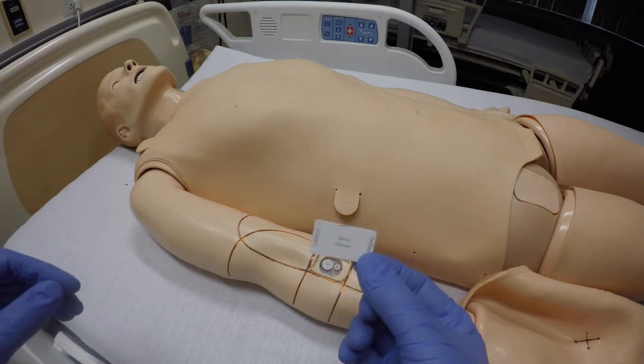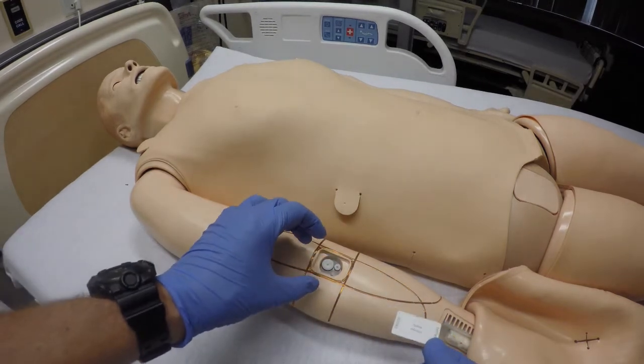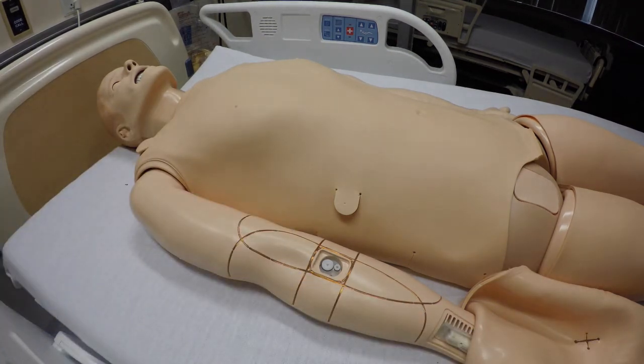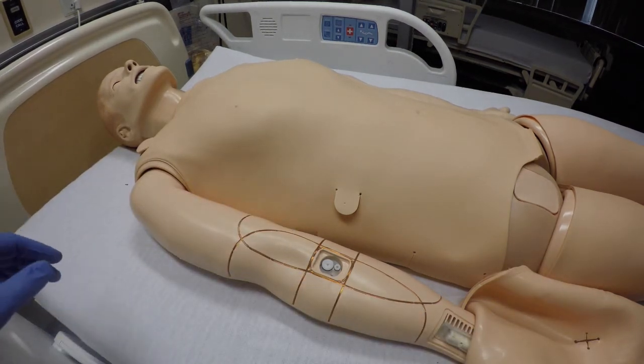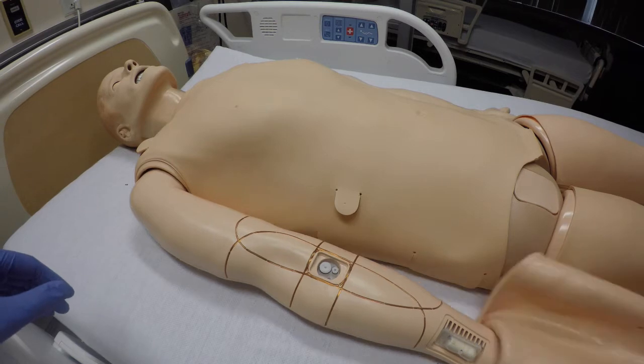Sometimes it can be caused by this — it's recommended to have the RFID tag in range in order to open that mechanism to allow fluid through. But we're still having issues, so we're going to go ahead and just remove that part and have the arm be free flow, because we don't use the drug recognition system on this mannequin for 3G.